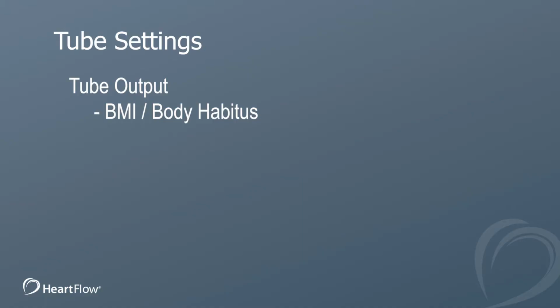Tube settings are very important. Body mass index or body habitus, size, shape of the patient has a great impact on image noise. And we offset image noise by increasing tube current settings or increasing kV. But there's more to it than that.